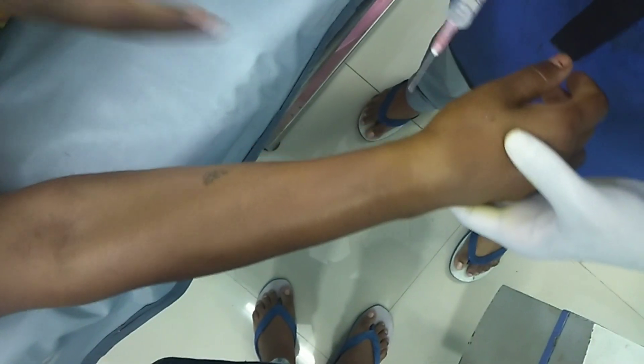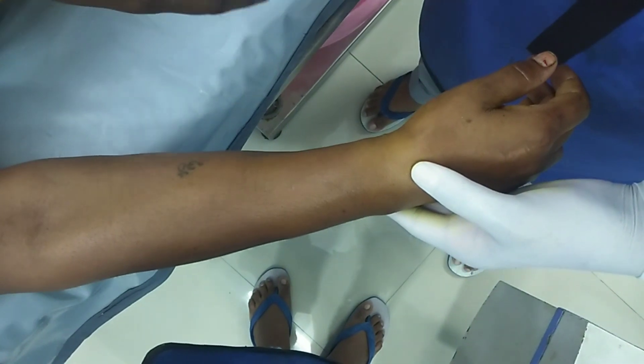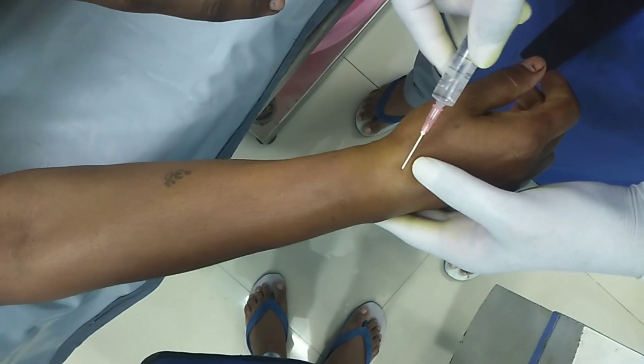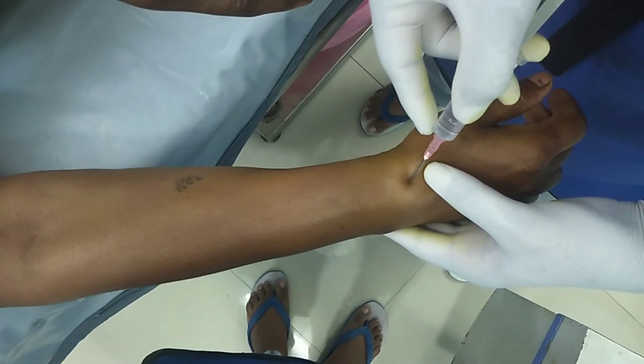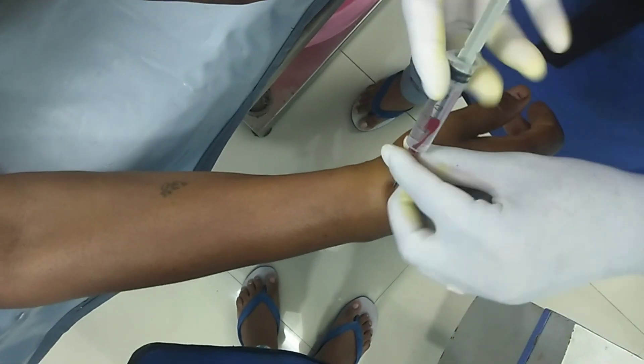In Colles' fracture we generally see mild swelling over the wrist joint. It is usually a blood clot which is formed. Just insert the 18 gauge needle from the dorsal lateral aspect of the wrist joint and aspirate it.